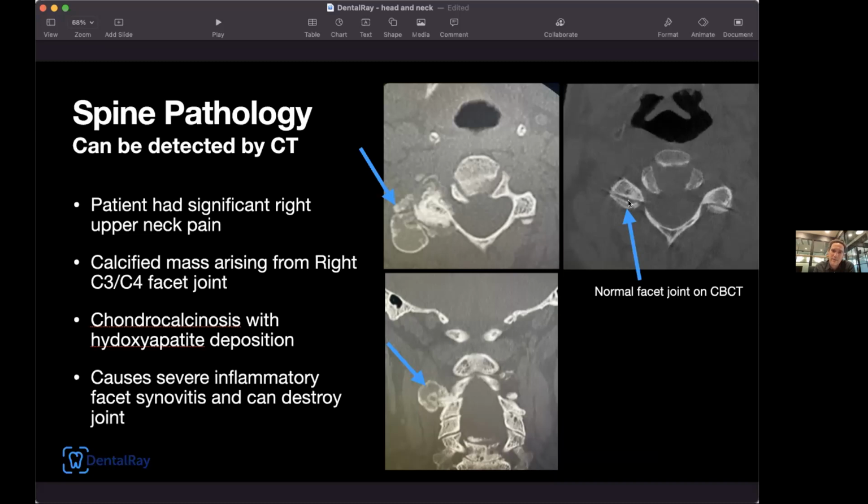And this is the cervical facet joint. And I think it looks like a hamburger. There's the top bun, there's the patty, and then there's a bottom bun, right? And this is where the side portion of two vertebrae intersect and slide against each other and allows you to have rotational and flexion extension movement.